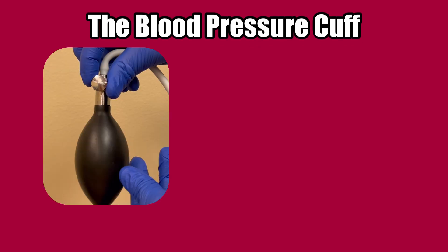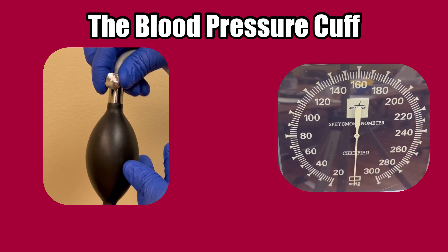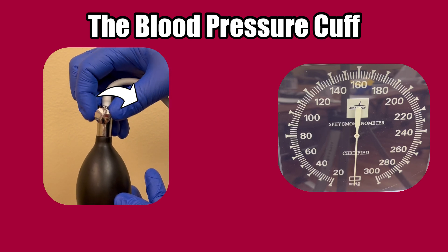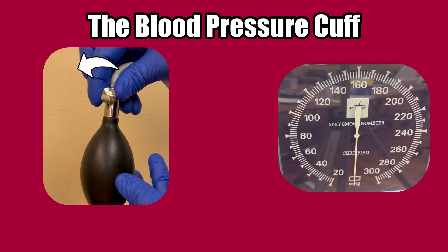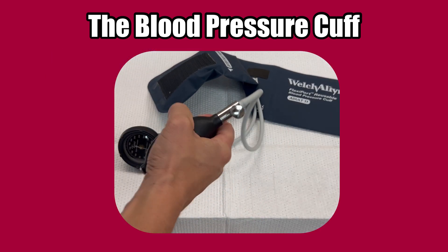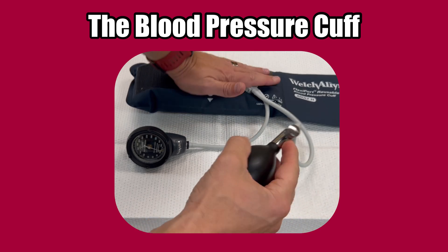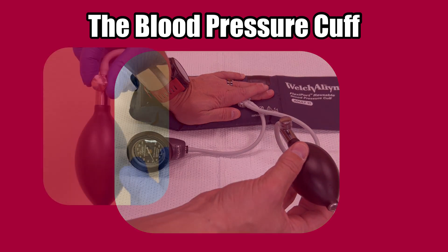The cuff is attached to two pieces. The first one is a bulb, and the second is the gauge. In the standard cuff setup, the bulb has a valve in the form of a turnable knob. To close the valve, turn the knob clockwise until it stops. To open it, turn it counterclockwise a little at a time — the further you turn it, the more open it becomes. With the valve closed, you can inflate the cuff by squeezing the bulb. To release the air, turn the valve counterclockwise. The further you turn the knob, the more open the valve, and the faster all the air will leave the cuff.